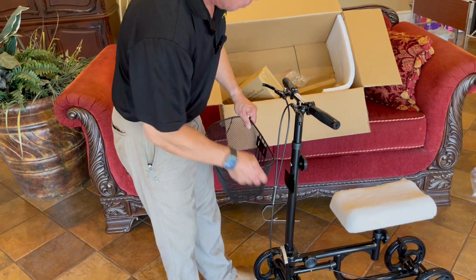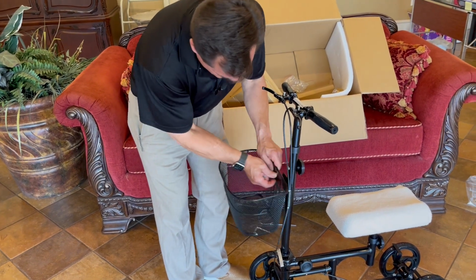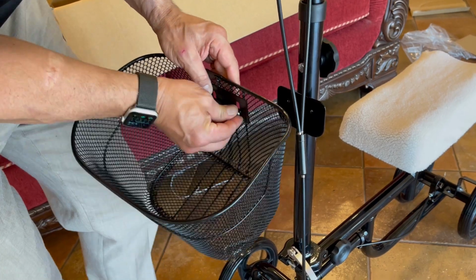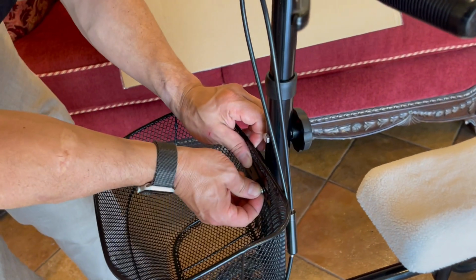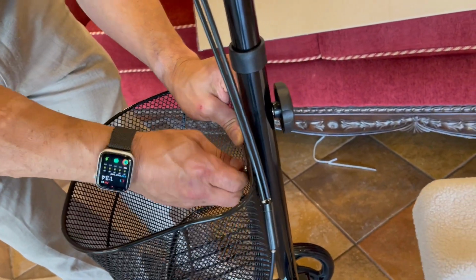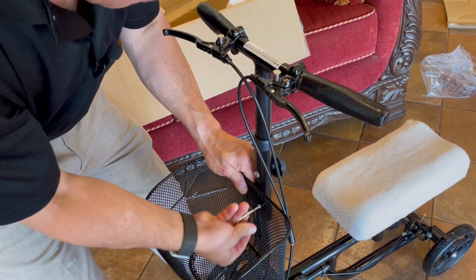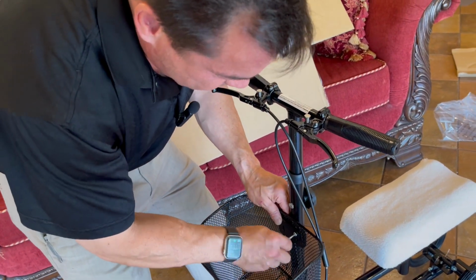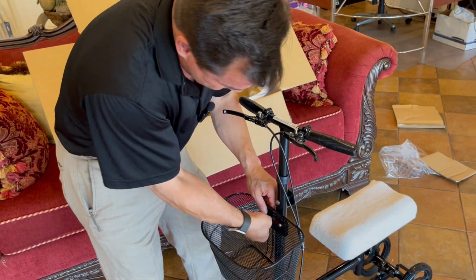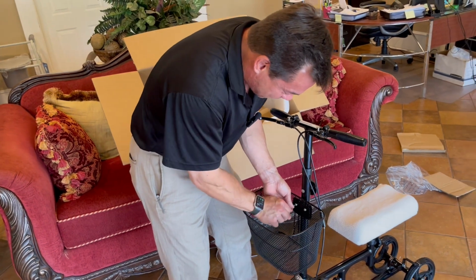And last but not least, putting on the basket. As we mentioned in previous videos, we're not really big on this basket, besides the fact that sometimes it's a little bit difficult to get on here and get everything together. It doesn't allow for the compact folding of this piece of equipment, and it makes it more difficult to transfer into your car, etc. If you got a small car, you won't be able to put it as compactly as you might have otherwise. So it's not always our favorite thing to put on for people, because a lot of times these things end up being brought back to us, and a lot of times our patients have self-remedied the basket issue by, let's just say, having it removed either forcibly or they actually take the thing off.